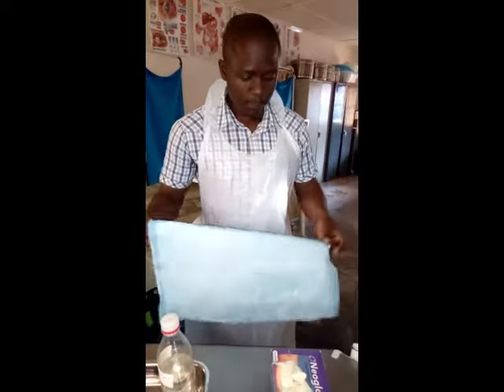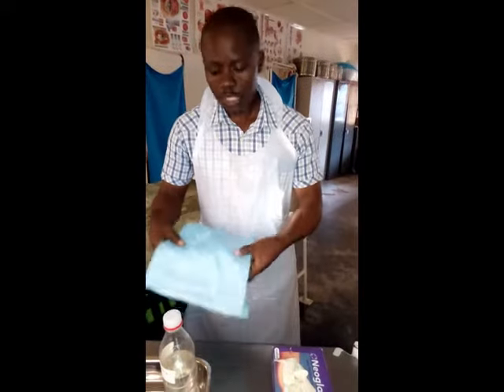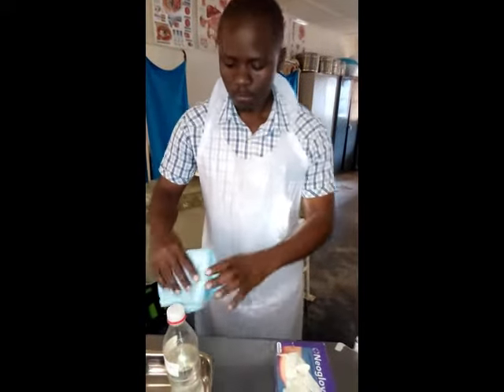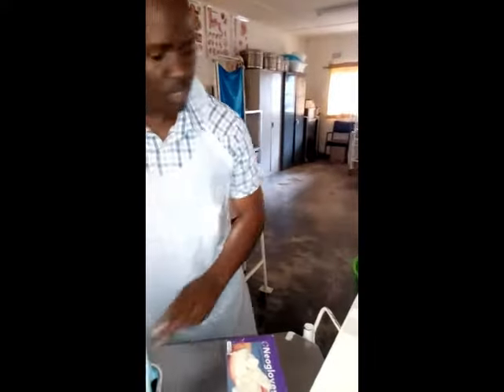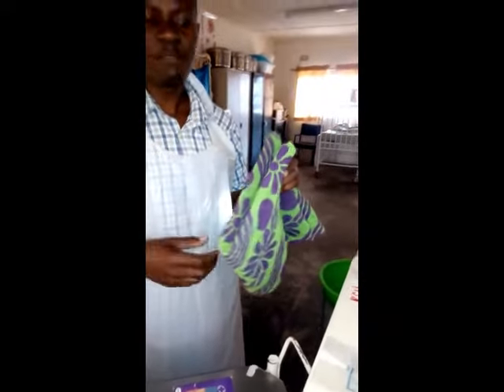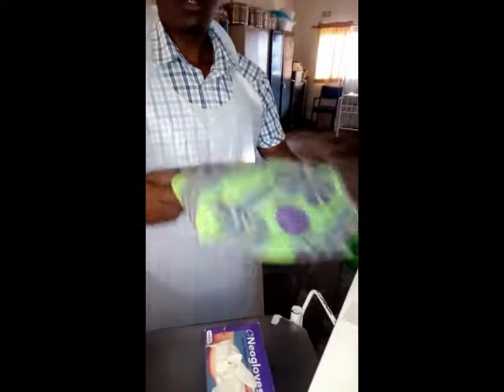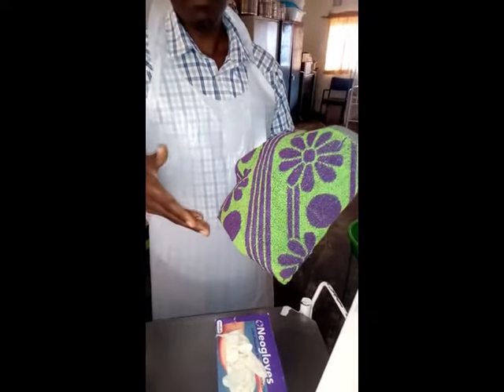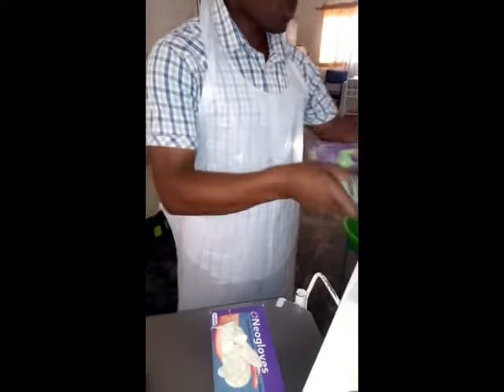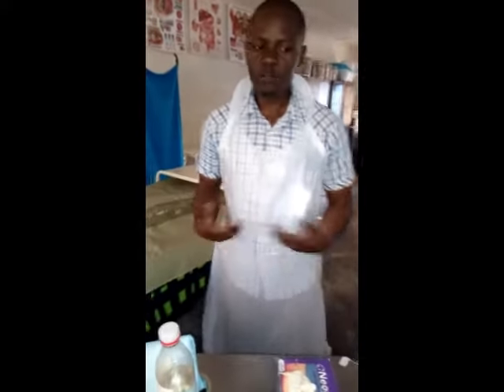Alongside, in case you don't have an incontinent sheet, you can go for a towel. Just an ordinary towel. At home we have these towels. Anywhere you can find one. So you can use any of what you find. As you know, in nursing we always improvise, so you can always go for that.